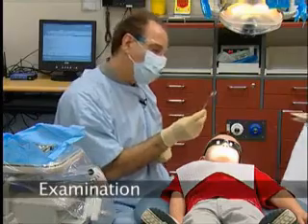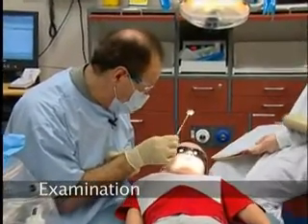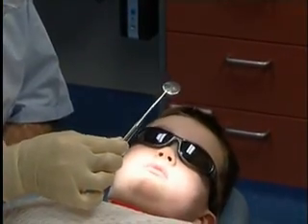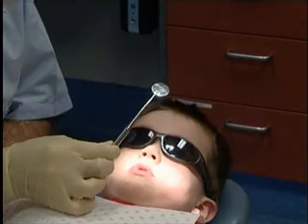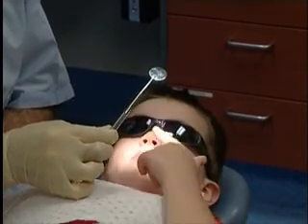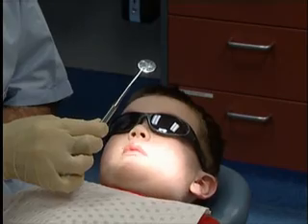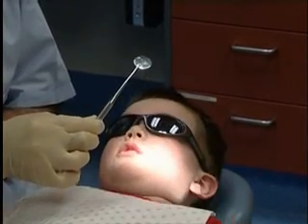Now what I'm going to use is this mirror. Can you see the mirror? Have you had this mirror before? Have a look in the mirror. Can you see your eyes in the mirror? Can you see that? I can see my glasses, but my nose, my mouth, my legs. You can see them in the mirror? And some of my cheeks. Okay. And where the stars go.